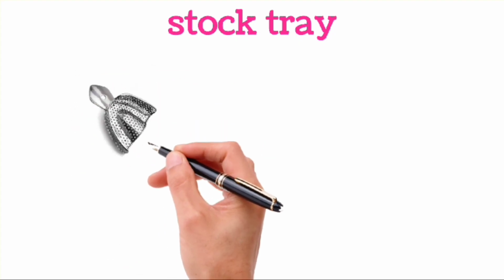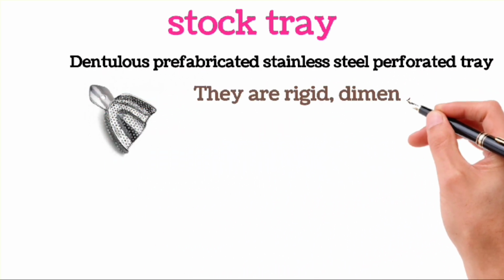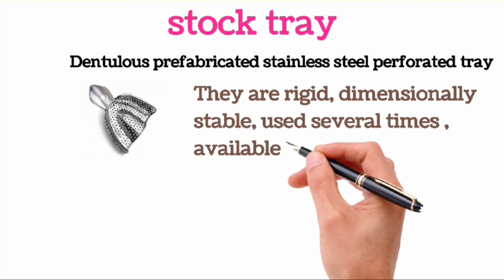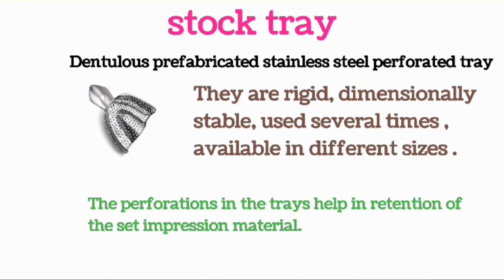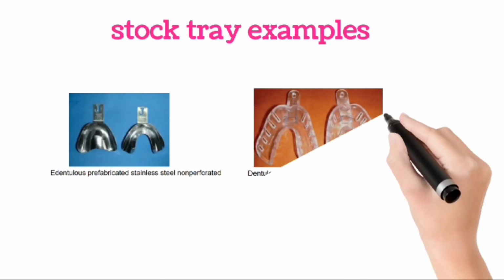Dentulous prefabricated stainless steel perforated tray. They are rigid, dimensionally stable, used several times, available in different sizes. The perforations in the trays help in retention of the set impression material. Image of stock tray.